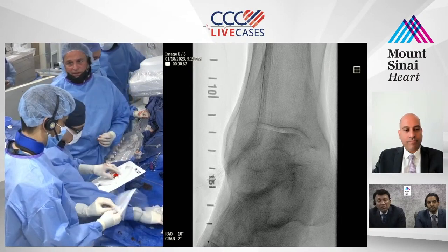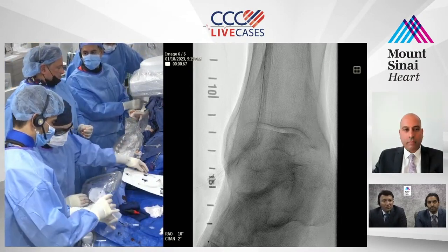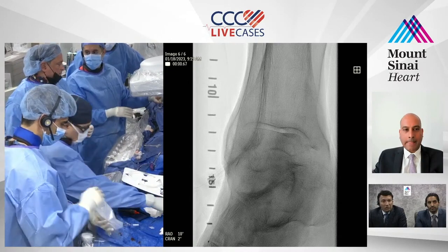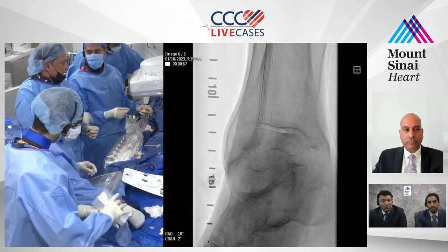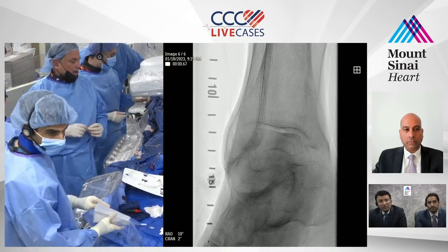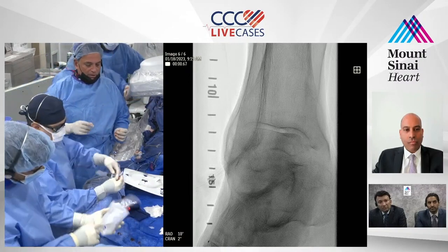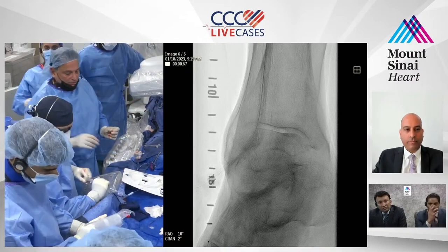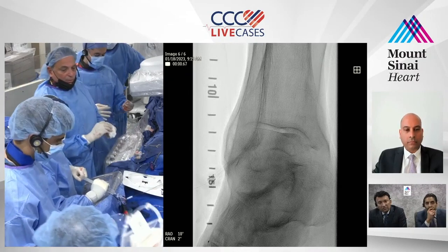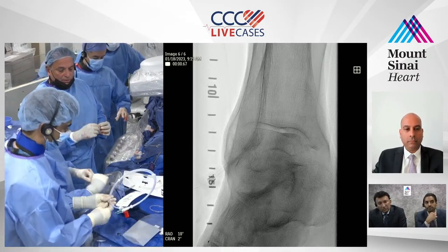So what I'm going to do now, Srini, the other way around. I want to put a microcatheter, swap your sides of the catheter so you can work all the way this way. No, what I'm going to do is internalize the wire and then push it up into the common femoral. I want to balloon the track so we don't get into any trouble. So what I'm going to do here is just balloon my reconstitution zone. Then I can do what Vishal was saying: put a microcatheter up, and then flip it all the way through and through.